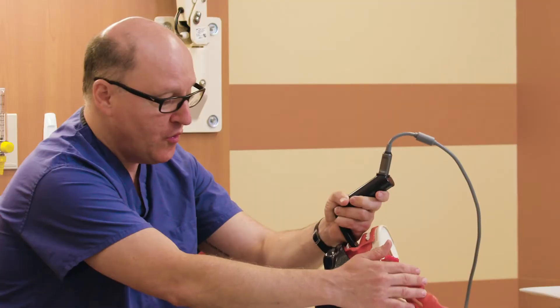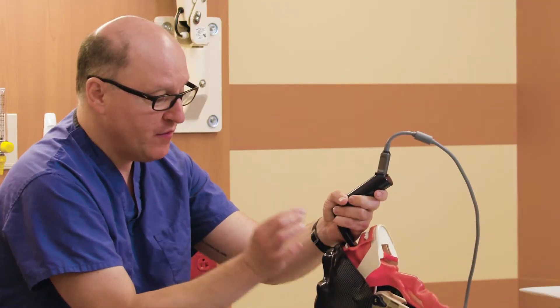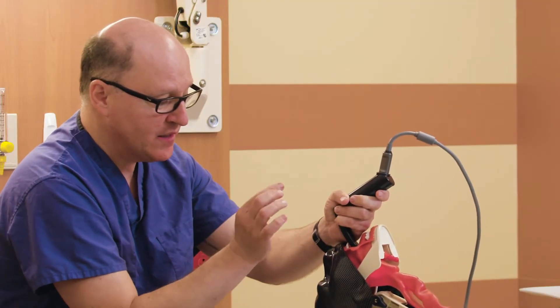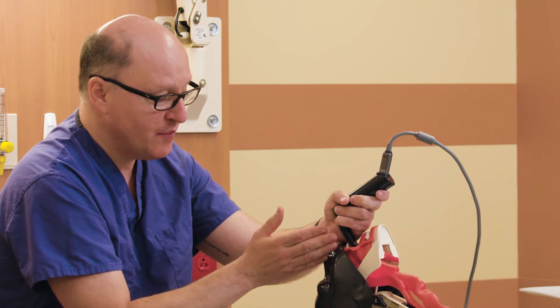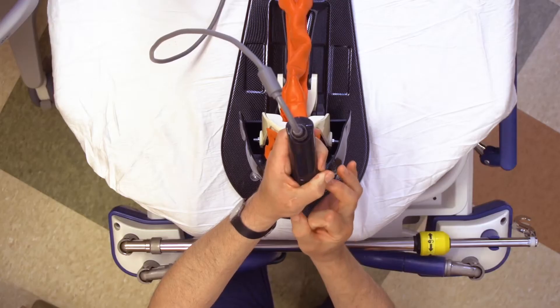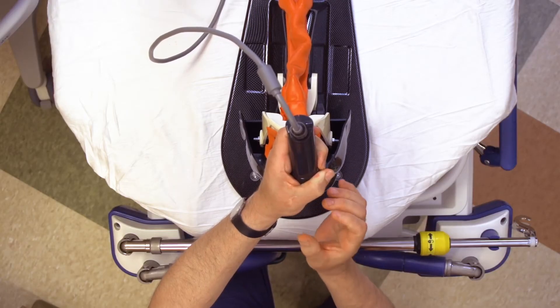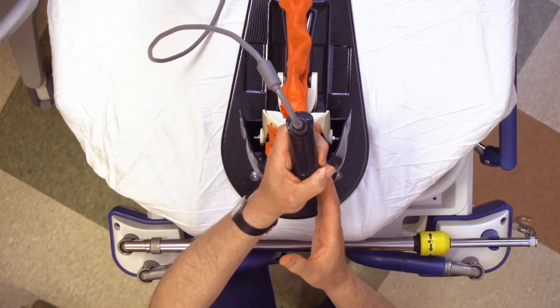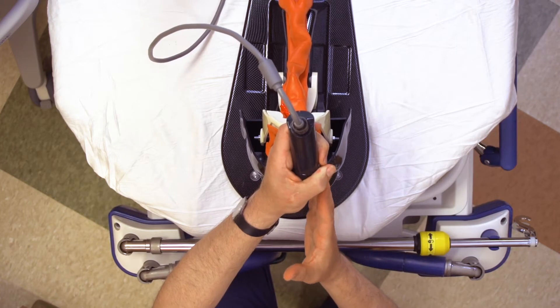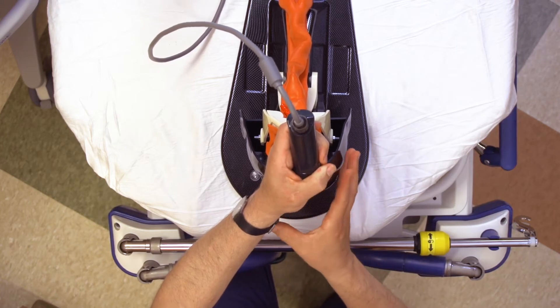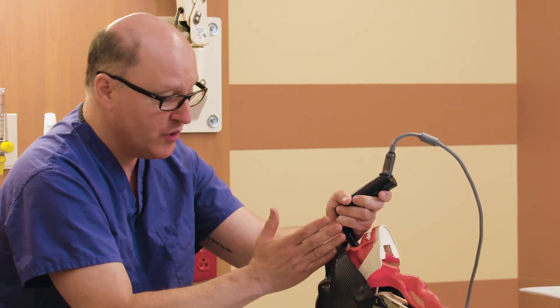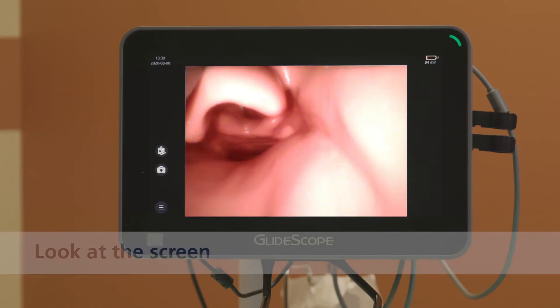So there is a very restricted visual access because of direct laryngoscopy. That visual access is created by the small flange of the Mac blade and this restricted mouth opening, so I'm only sighting the target with one eye.